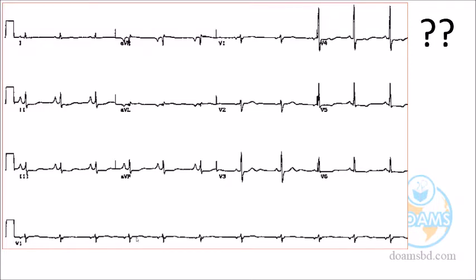If we can identify the features in favor of P pulmonal, it will be easy, but sometimes the ECG may not be that clear. In V1 the P wave is not much clear. Dr. Ibrahim, what is your opinion? Yes, in V1 it does not appear clear. Rather, lead 2 is clear, lead 2 and lead 3. Many leads may show the feature. So what could it be?